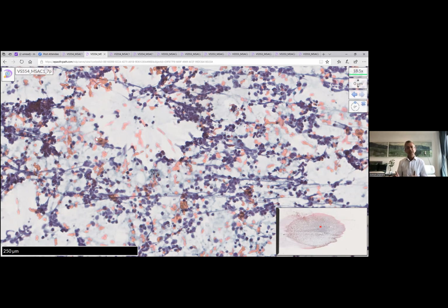So if you then have a small table there with your neuroendocrine markers and the appropriate lymphoma markers, obviously I wouldn't expect Hodgkin's to be in the differential. I wouldn't expect a CLL to be in the differential. Your differential here is with a high-grade DLBCL type of lymphoma, but it just hasn't got the other features that would support it on morphological grounds. But if you're stuck, and if you really feel I don't want to risk getting this badly wrong, I think it would be safer to offer a differential. But then how I would resolve that differential, you would still get the pass mark at least.